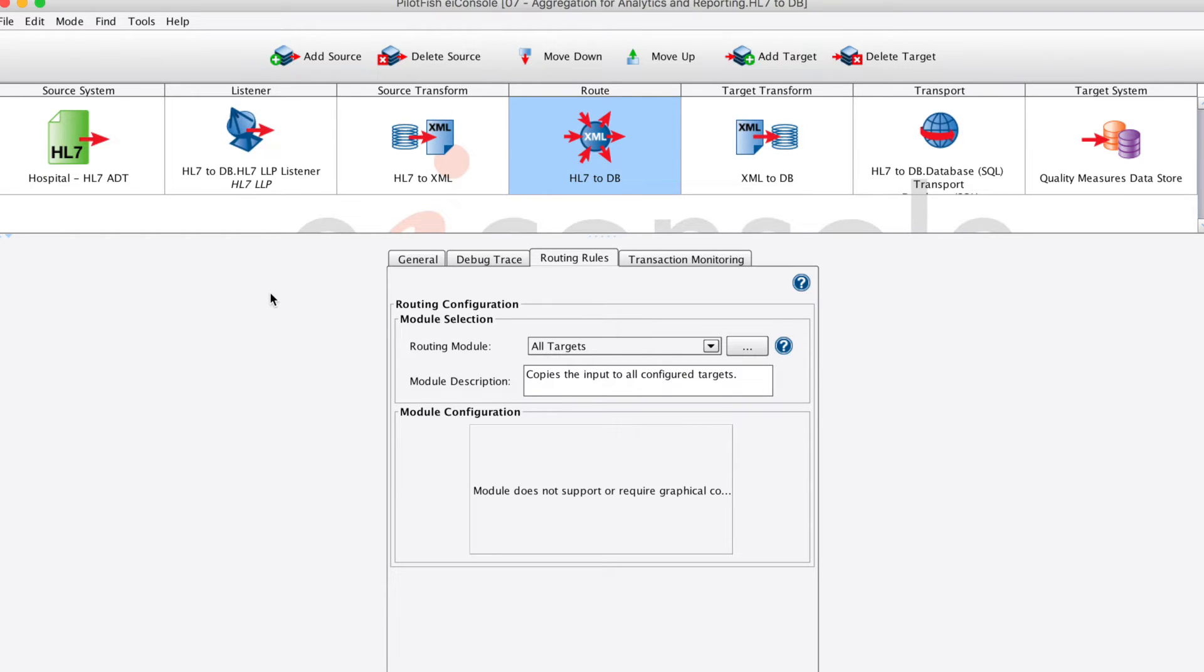In the routing stage, we route the data along to our single target system, which includes the target transformation to convert our generic XML representation of the HL7 into the specific SQL database statement.